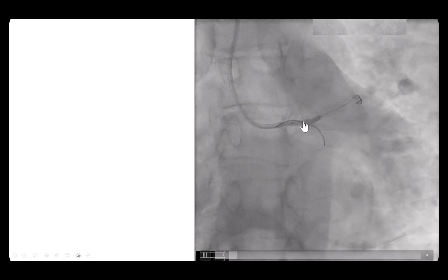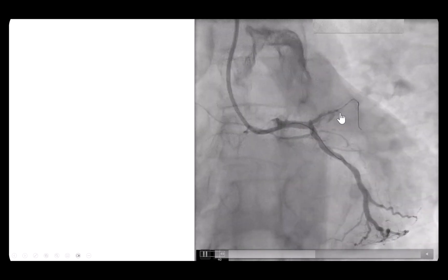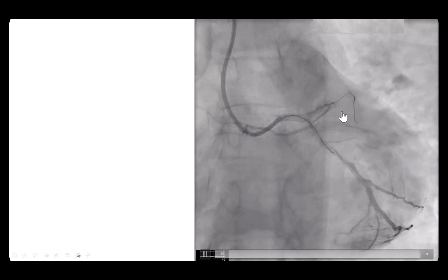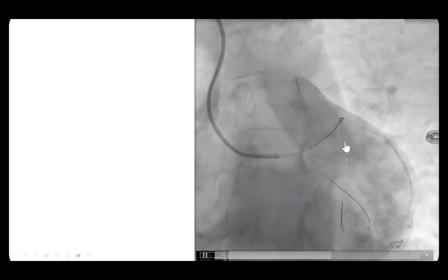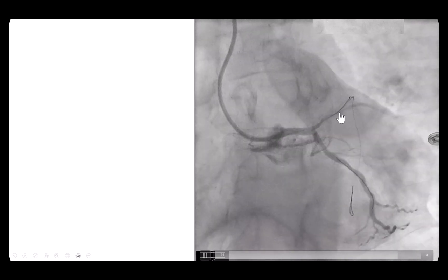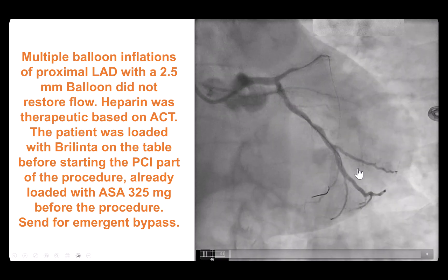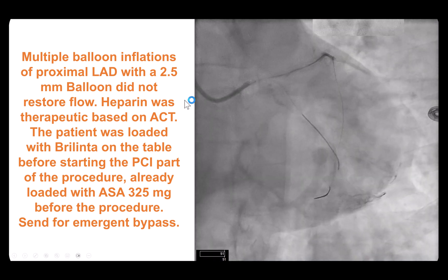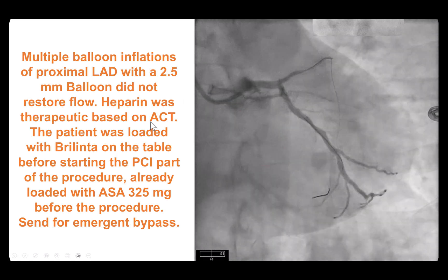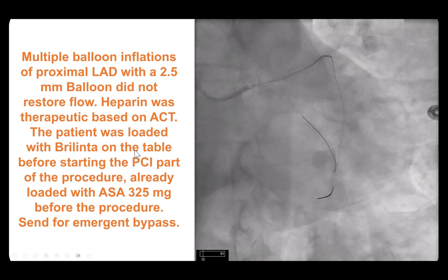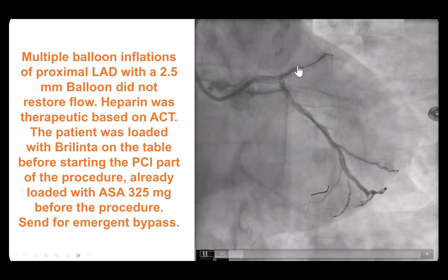A wire was advanced through the LAD and balloon angioplasty was done. There is some flow starting to come back, with some flow into a septal, but still the whole vessel is occluded. The wire was advanced further down — it appears to be in the course of the LAD, and encouragingly there is some flow into the large diagonal branch at the proximal edge of the stent. Despite multiple balloon inflations, there was no restoration of antegrade flow. There was concern for thrombosis, but the ACT was therapeutic and the patient had been loaded with ticagrelor prior to the procedure. After multiple attempts, the patient was sent for emergency bypass.